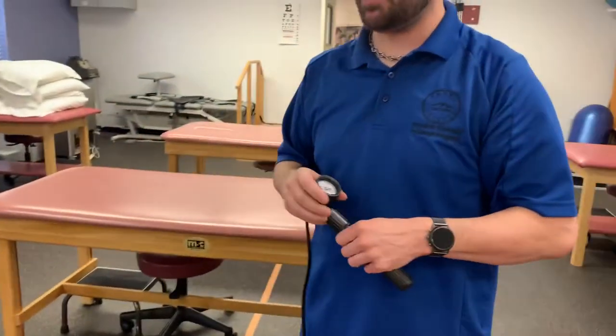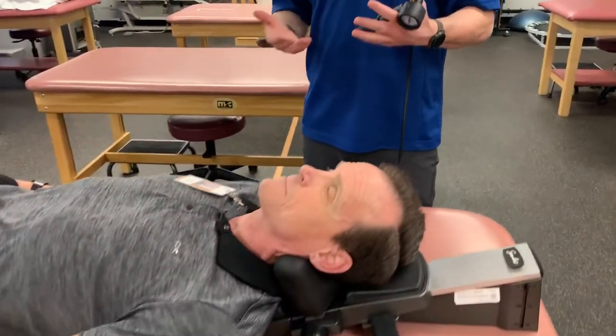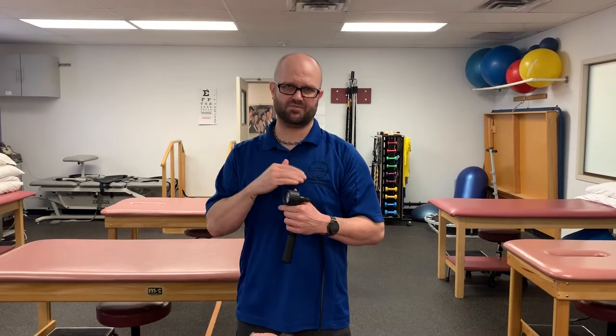So we'll start with pump. I didn't really mention the amount of pressure or pull we're supposed to have on these machines — that's going to be covered in lecture, but make sure you're familiar with how much pressure to apply for lumbar versus cervical traction depending on the diagnosis. One thing I will mention: if it's acute or if this is the first time the patient has ever had traction, we're going to keep everything static — no intermittent pressure, no hold and relax time.